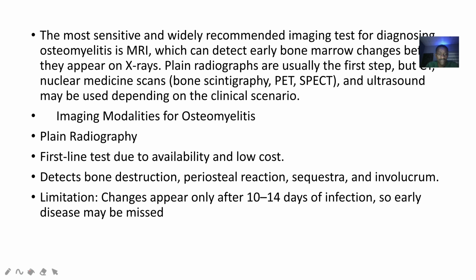Well, the imaging modalities for osteomyelitis are as follows. We have plain radiography. It is the first line because it is affordable. It is easily available. Almost every hospital you go to, you see this.